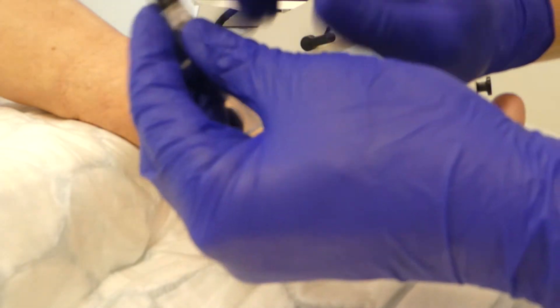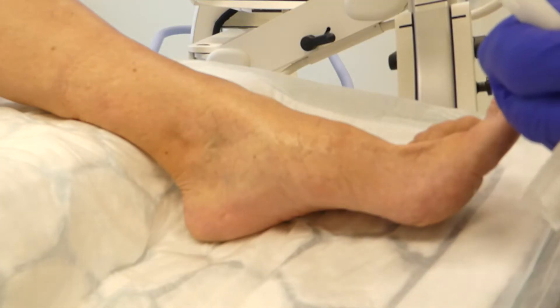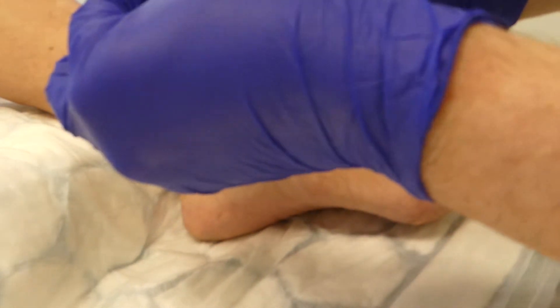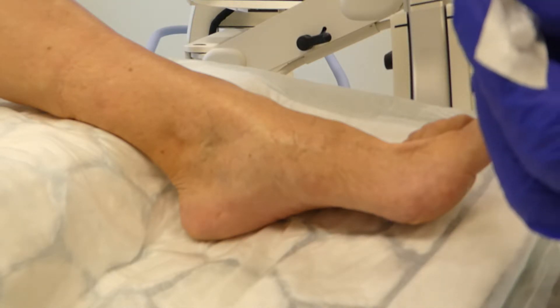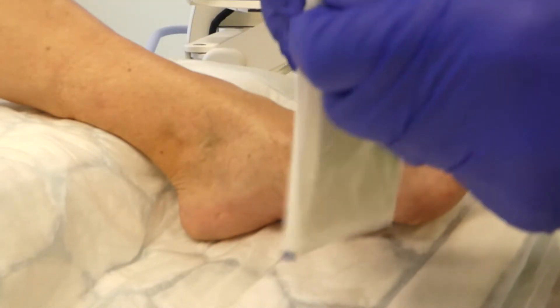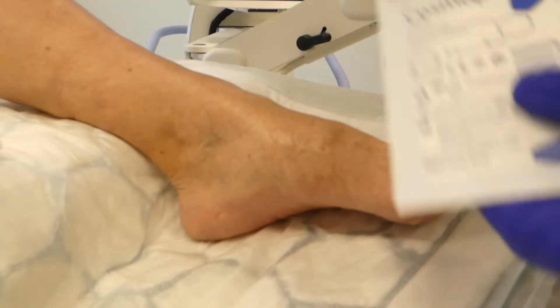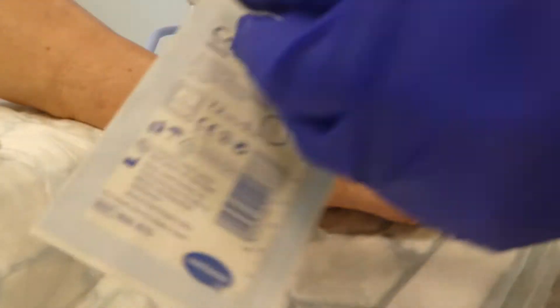A little bit of local anesthetic — this dilutes nicely and just increases the volume, making it easier. We've got about 2mls there. Take out any spare fluid and we're going to use a 27 gauge needle. We normally use these just for the private patients, but Pat works for the health service so we'll use that as well. Get rid of that one — binned. The 27 gauge needle is going to be very handy for those small joints. Preparation is the key: a bit of gauze in case there's any claret, and a couple of dressings, a bit of Cosmopore.